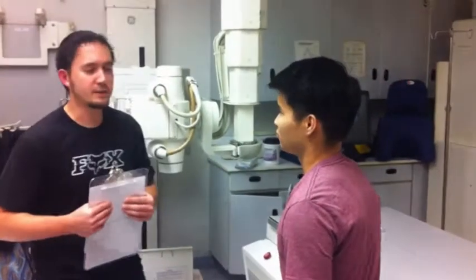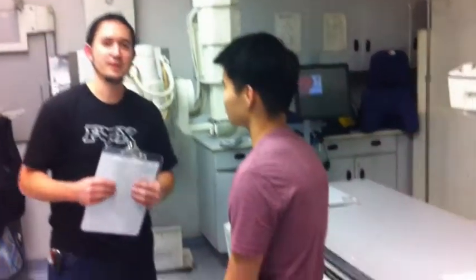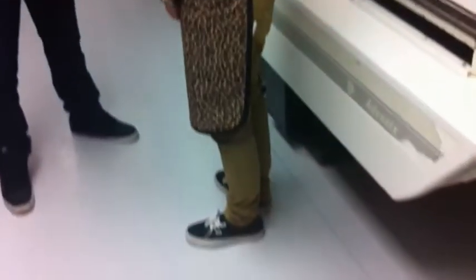So now we're going to bring in the patient. Before the exam, you want to make sure that you double ID them, ask them the full name and the birth date. Sir, what is your name? My name is John Rivera. Birthday is April 3rd, 1991. And if they're female, you want to ask them if they're pregnant or not. Sir, are you pregnant? Nope. Okay. Another thing too, you want to check on history.